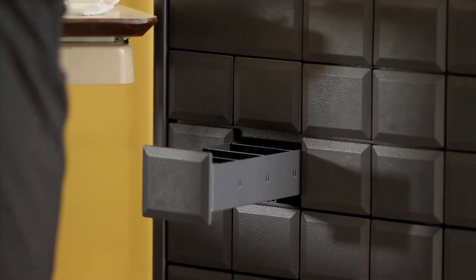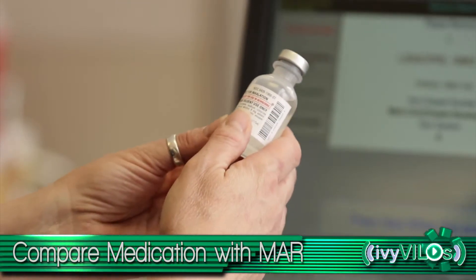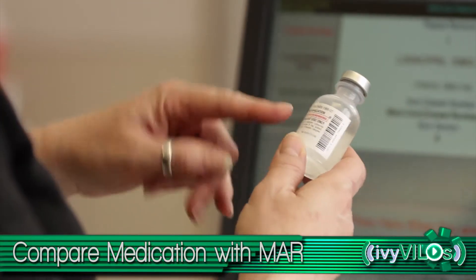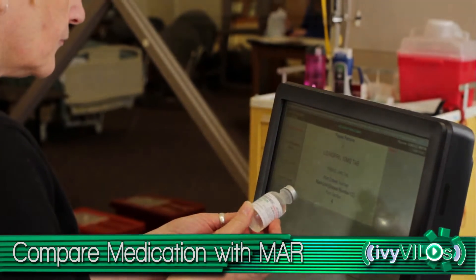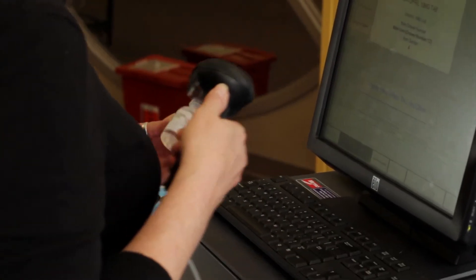Compare the medication label with the medication administration record and make calculations if needed. Only prepare medication for one patient at a time. Scan the medication barcode.